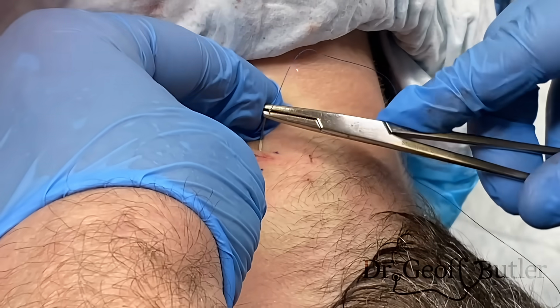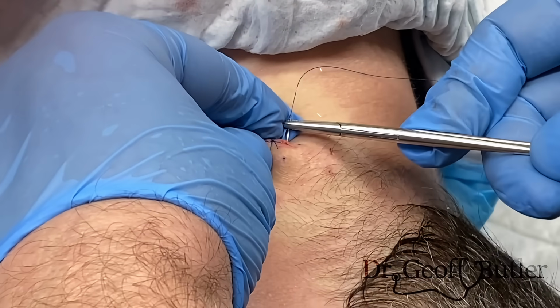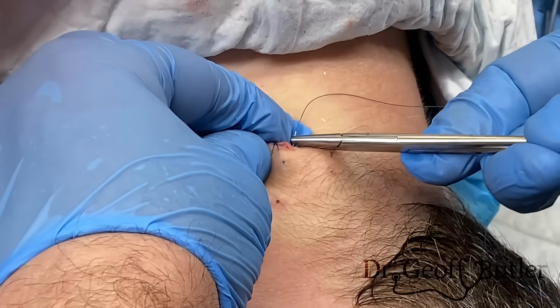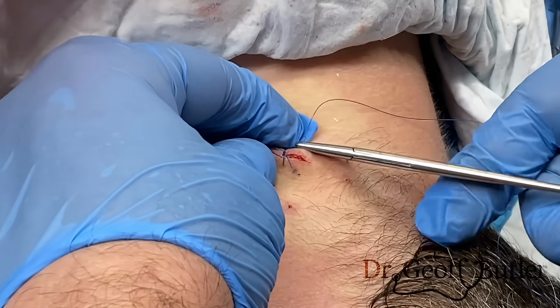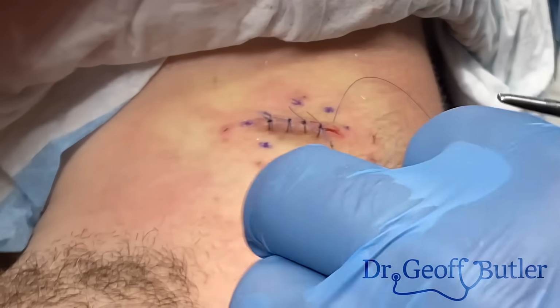So in here again, we drive this in at 90 degrees, at least to puncture the skin. Once you've punctured the skin, you can turn pretty quickly. But if you try to put it in at anything other than 90 degrees, special areas like this, you'll fight with it, and you can sometimes bend your needle and have trouble.